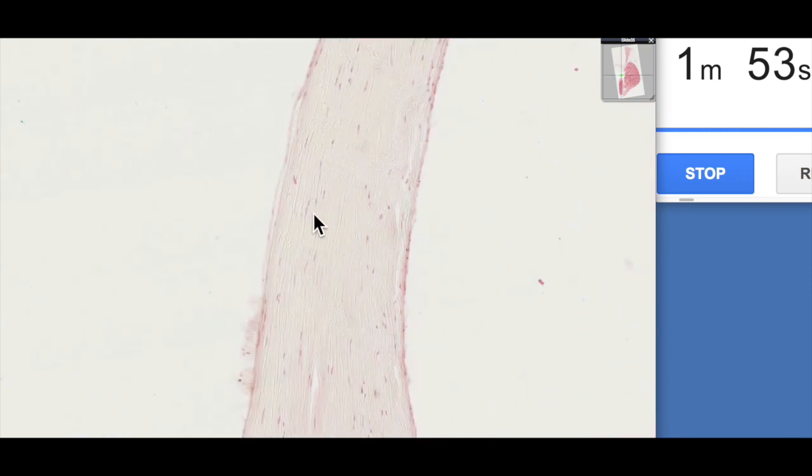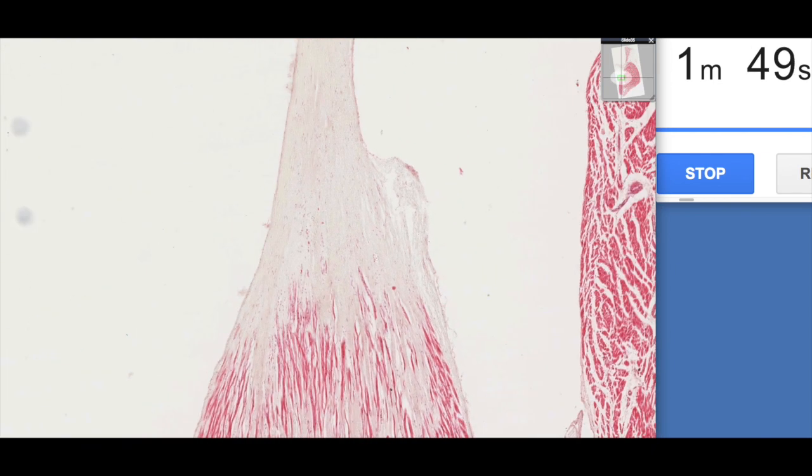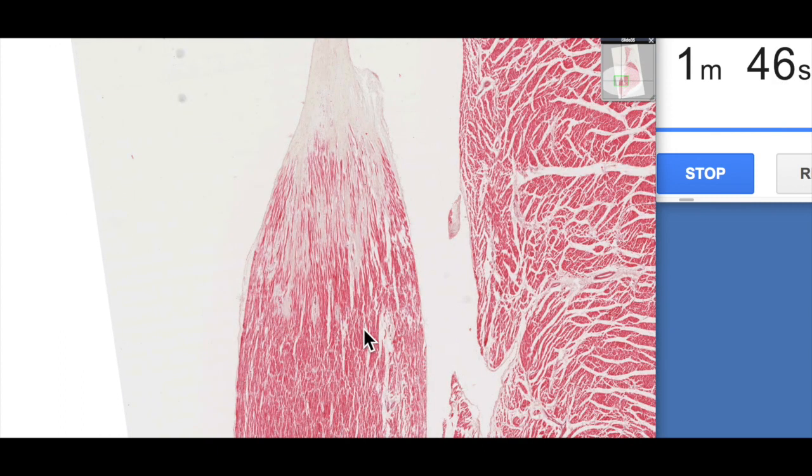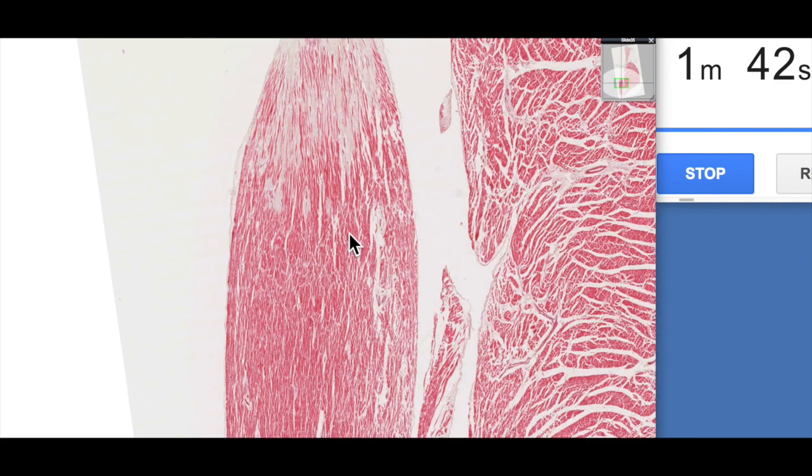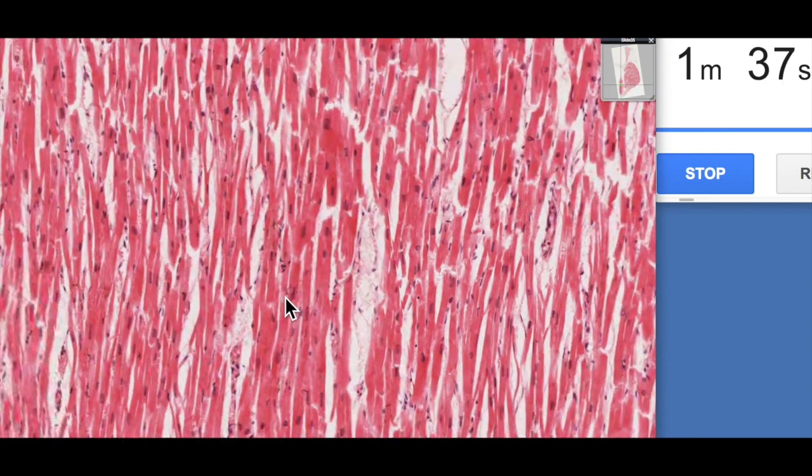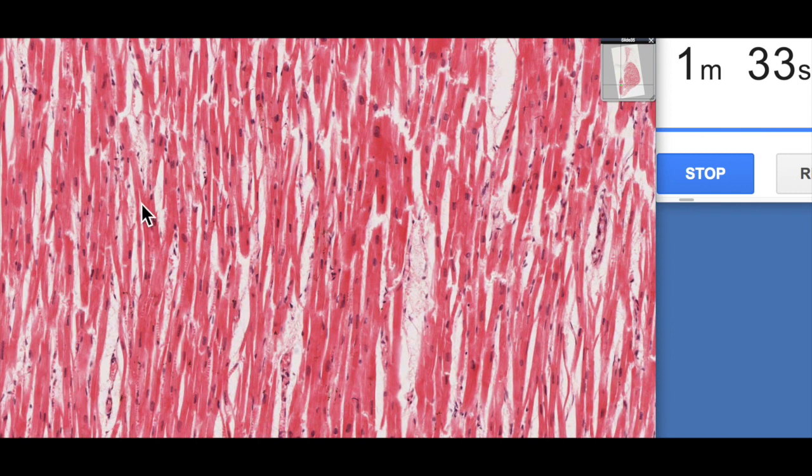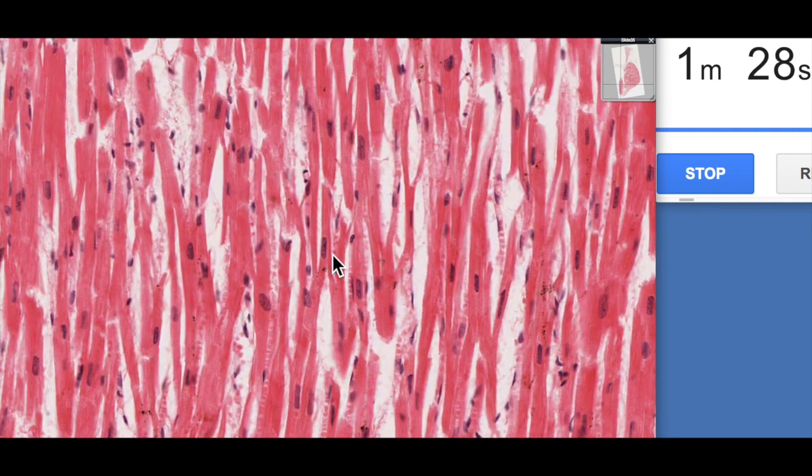This is a papillary muscle, an extension of the ventricular wall. It's made up largely of cardiac muscle cells. If we zoom in here you can see the branching nature of the cardiac muscle cells. If we zoom right in we'll be able to see some striations, you might be able to make them out here. Nice little capillary here.